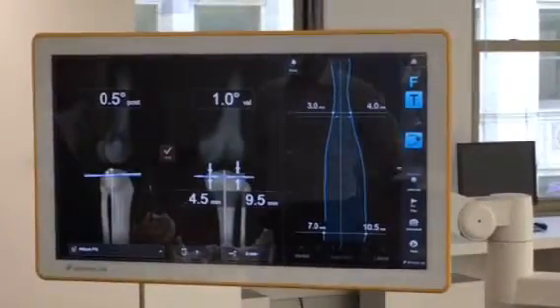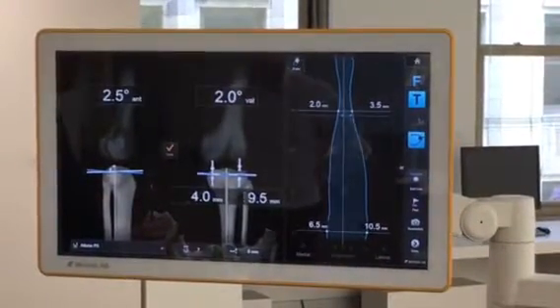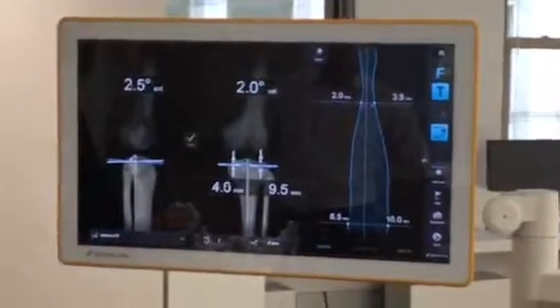So this is all gesture driven now. There's no more workflows, and the software follows me. So as the surgeon, I'm the one dictating what's happening in the case, right?